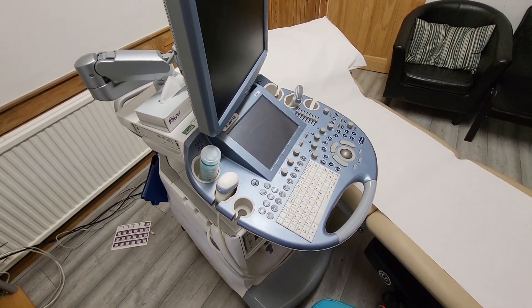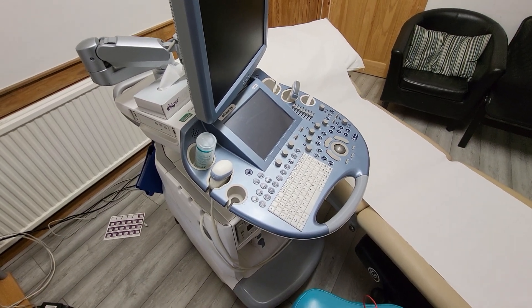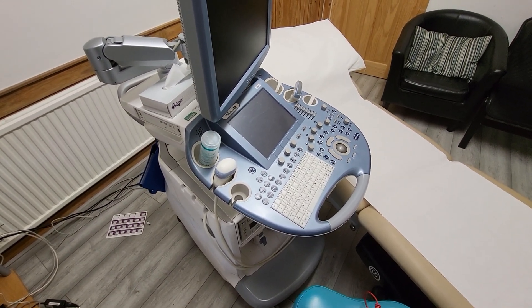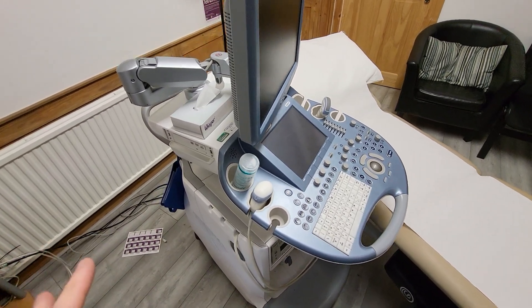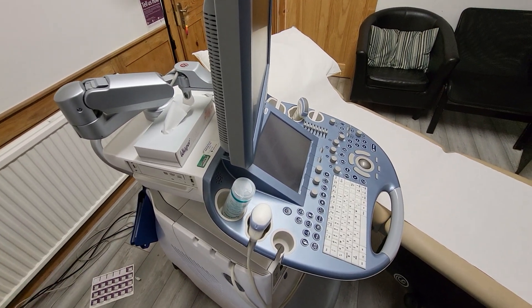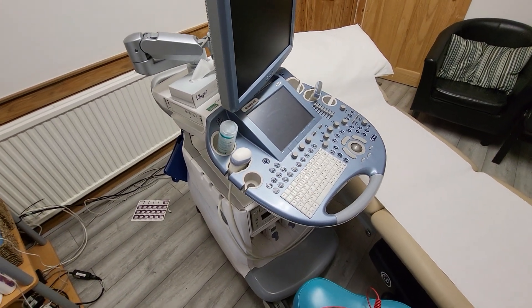They don't come under the remit of a standard PAT Tester. They have to have a special medical PAT Test done on them. It's not defined in our normal code of practice — there's a completely different code of practice and standard to work to when PAT Testing medical equipment.